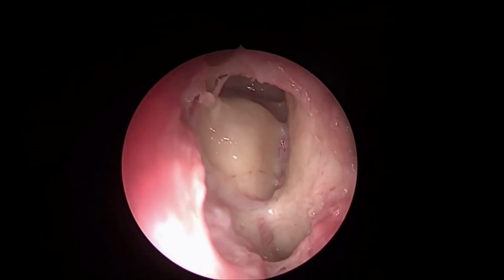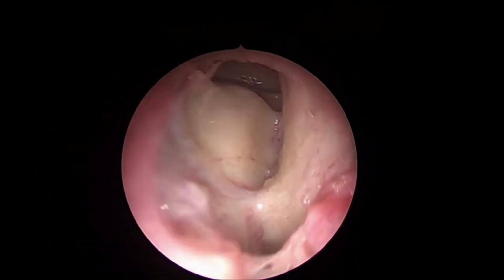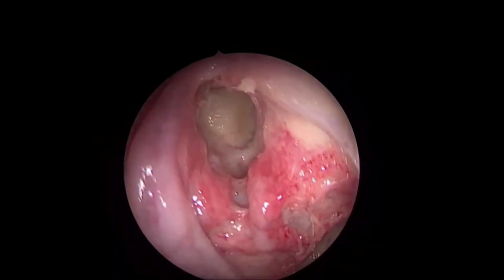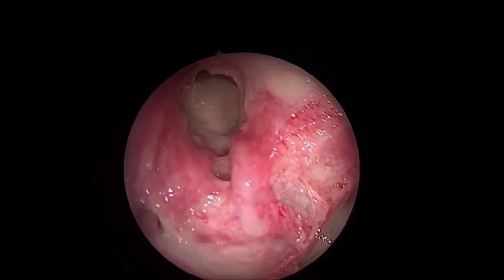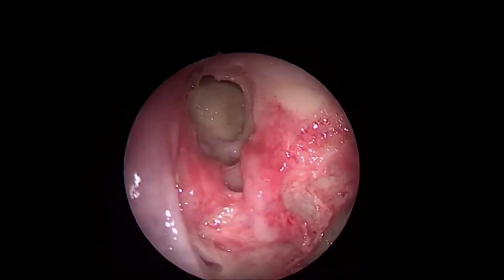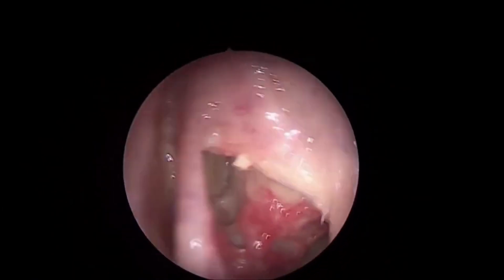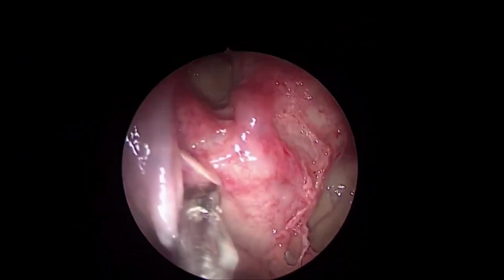And this artery, see this, it is not covered by any bulla or anything. Your instrumentation can damage it. So the pre-op radiology is so important, you need to see whether the bulla is reaching the skull base or not. And in that situation, your intact bulla technique protects your ethmoidal artery behind from being damaged by the surgeon. And these concepts were very well propagated long back by our own Professor Sethi. We discussed in the last webinar, and Professor Sethi was there, this concept of the intact bulla technique. So thank you, Prakash Mukha sir, for this interesting discussion.